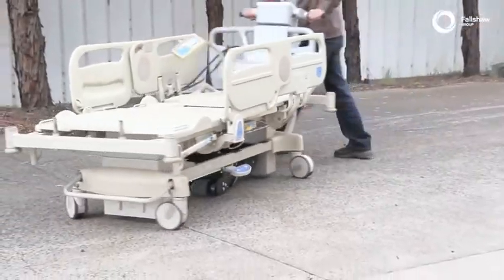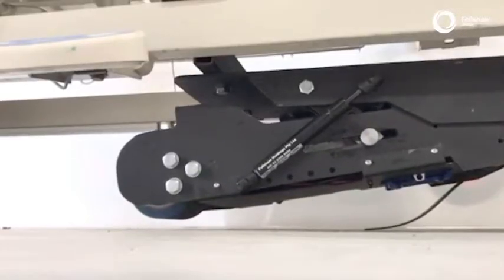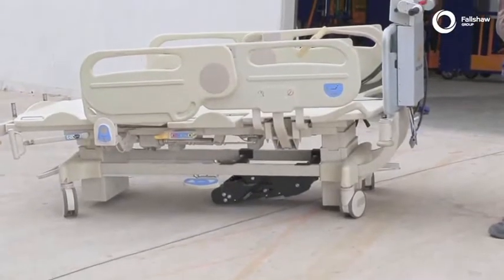When used on hospital beds, the retractable wheel feature enables the drive wheel to lift, providing maximum manoeuvrability of the bed.